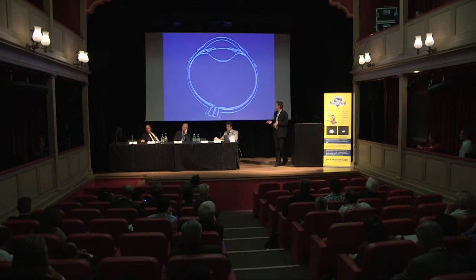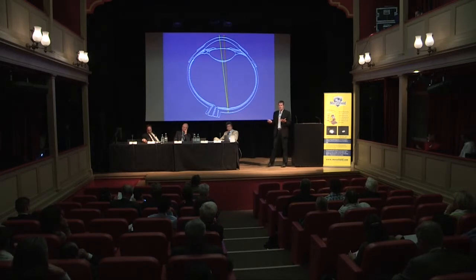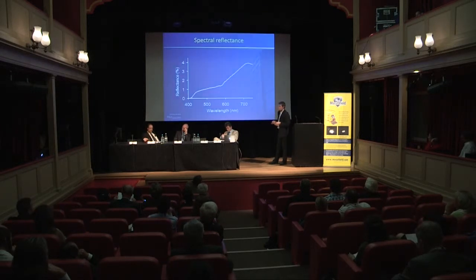What's reflectance? Well, that's actually what you do as an ophthalmic doctor. You just look into the eye and you look at how much light is reflected. Instead of being a doctor looking, oh, this is white there, or this is black, I'm a physicist, so we try to have numbers with this. So this is what comes out.